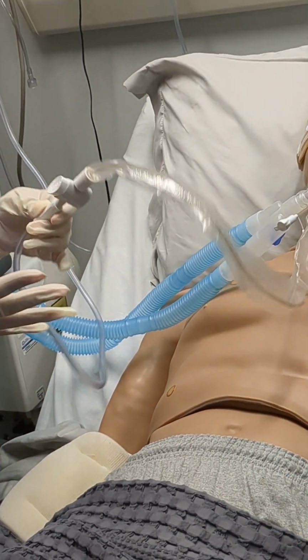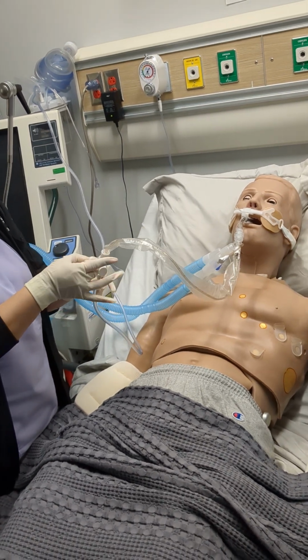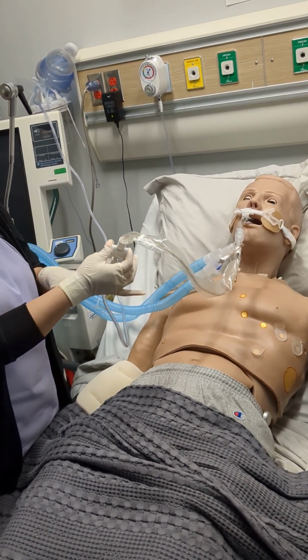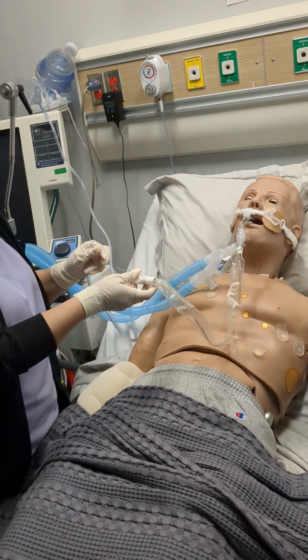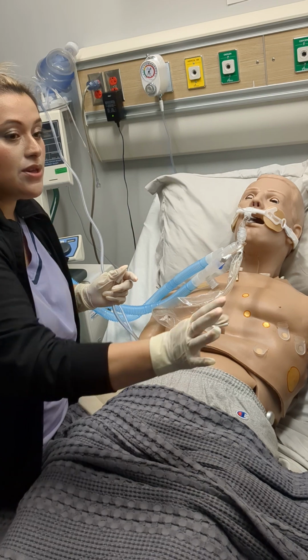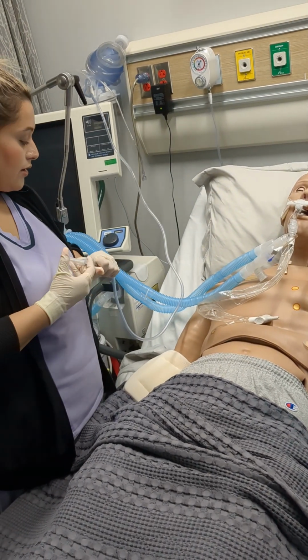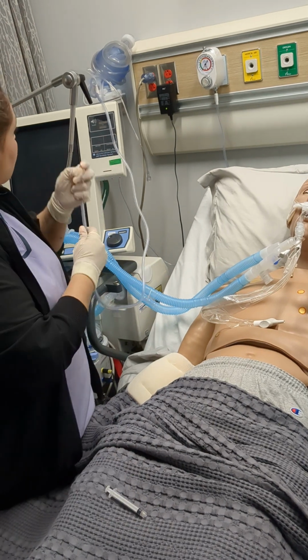And then with the babies, sometimes because they have such little secretions, we may have to tap this a little bit to make sure that the secretions run out. Okay, what I do next, I lock it, I put the little connector here, I leave it on my patient, and the rest of the saline that I had left, I connect it here, and I push it in so that this is nice and clean.